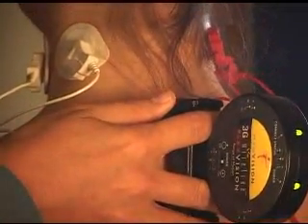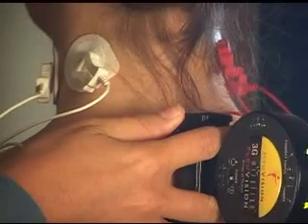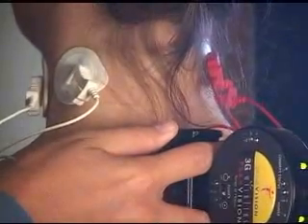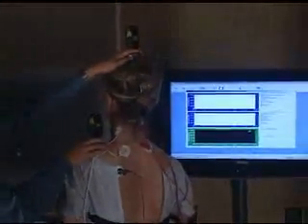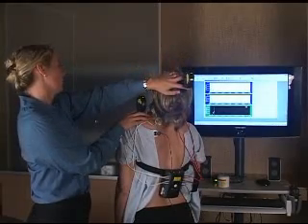Now if you get done earlier than the 30 seconds, you can hold the button down for 2 seconds and it'll move you on to the next screen, where we're going to measure extension. You can leave the probe behind the patient like it is, and always leave the probes right where they are, and then press the button and hold it so you don't remove the probes from the skin. So here we have extension, and you can place the device on the shoulder if you want to.